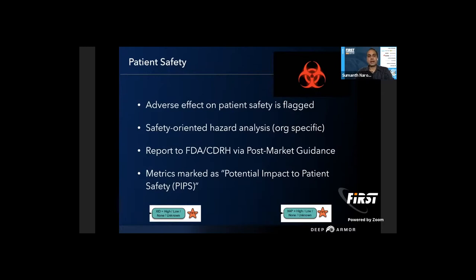The idea is that if a certain marker has come up for PIPS, then you may be required to do an internal safety-oriented hazard analysis and report this to the FDA as part of your post-market guidance. This is one of the activities commonly associated with class 2, class 3 medical devices. So this ties in nicely, where, as part of the scoring mechanism, you're also providing that information to the FDA.